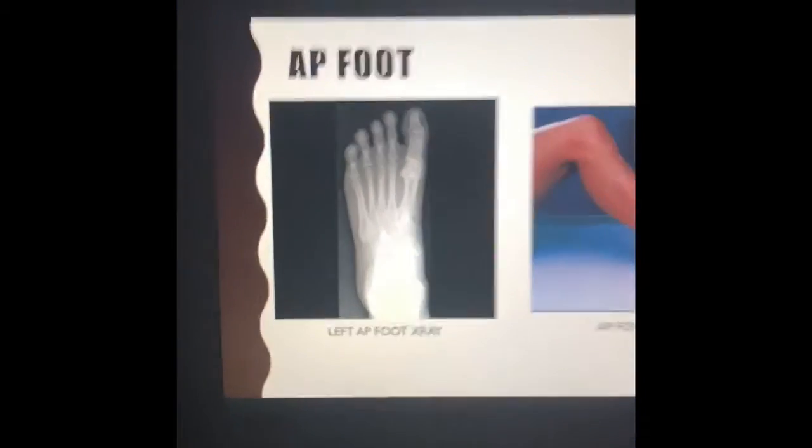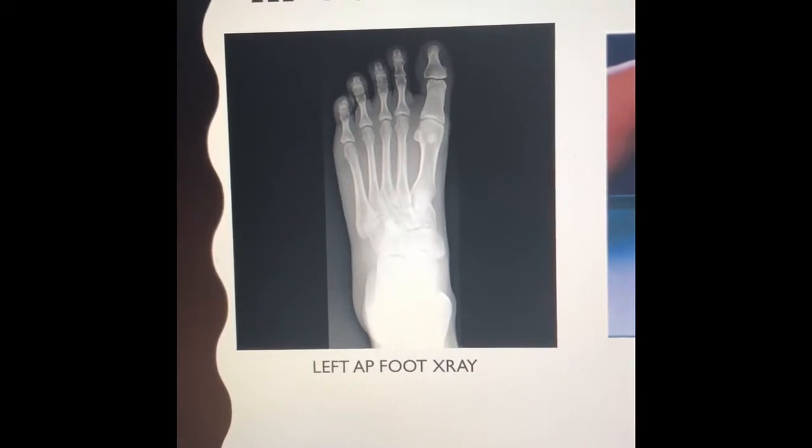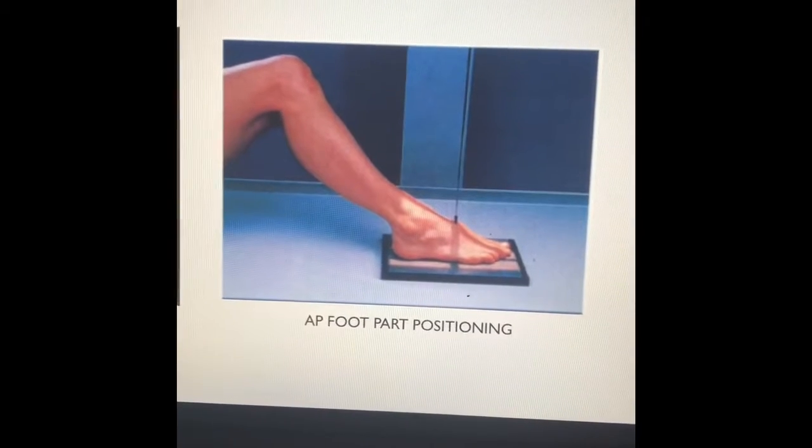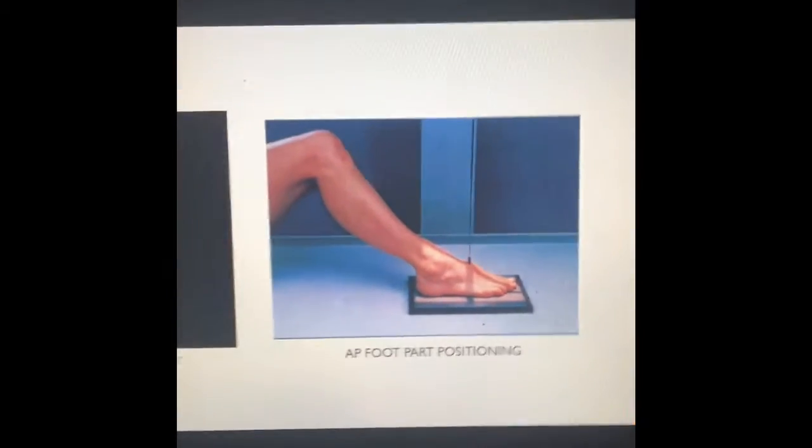AP foot. This is an x-ray of a left AP foot. On the right, you'll see an AP foot part positioning projection.